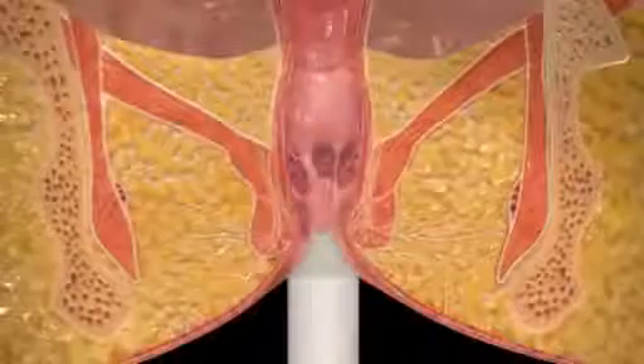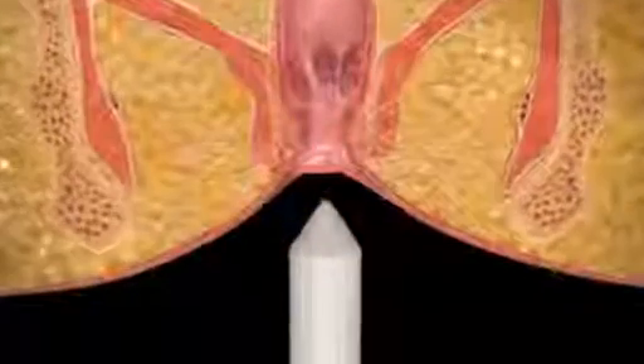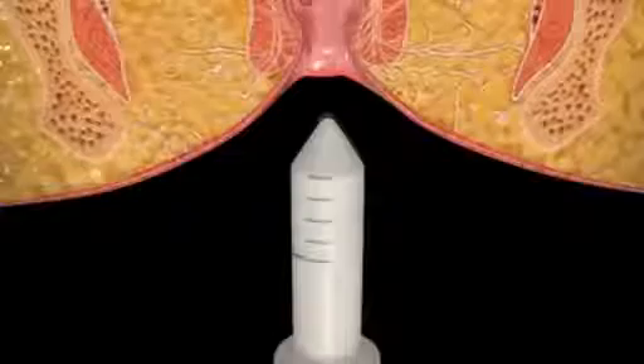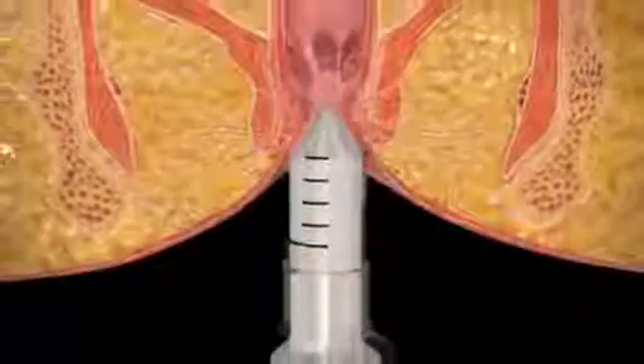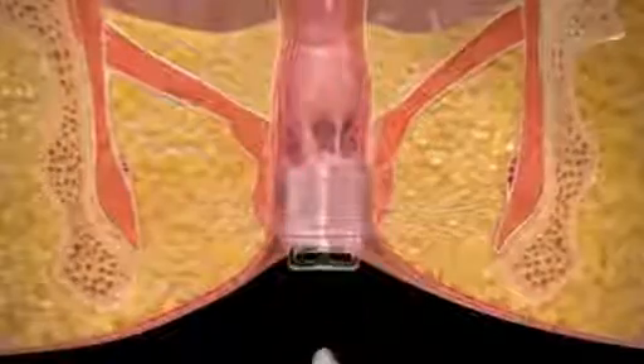With the patient in the supine position, digitally reduce any external hemorrhoids to facilitate insertion of the anal dilator. Lubricate the dilator and insert into the anal canal and remove. Lubricate the complete anuscope kit — dilator, anuscope, and port — nested together and insert into the anal canal. Remove the dilator and anuscope, leaving the port in the anus.